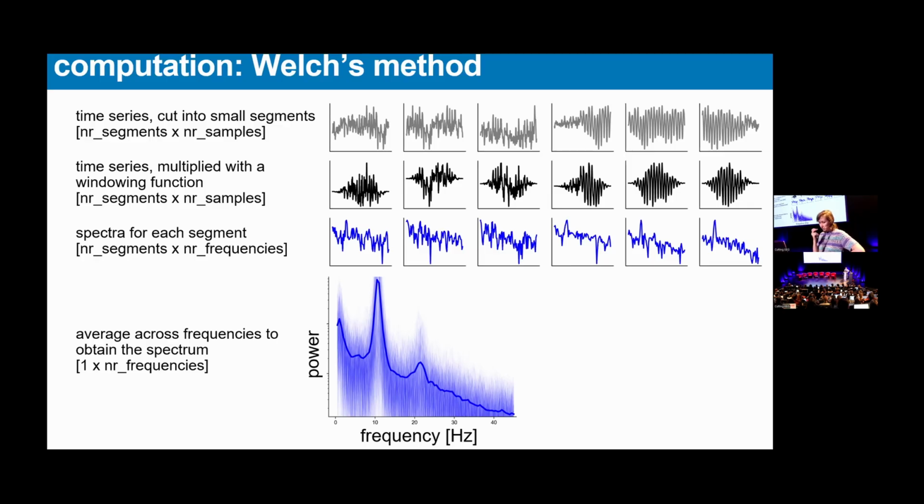And we can plot a very common representation in MEG-EEG research, which is a spectrum. So here is the average spectrum in dark blue. And you can see there's definitely some variation around the average. All right, so this is one of the main outputs of spectral analysis. So let's check what we can do with it.